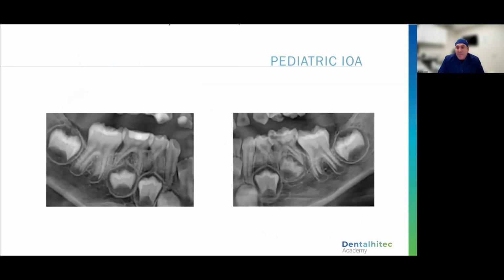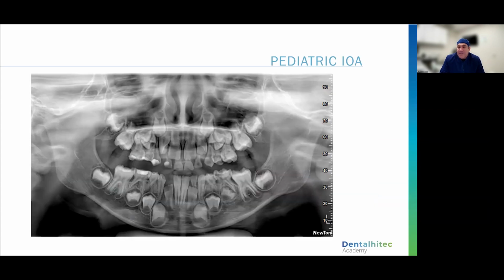There's no difference. We definitely want to review our radiographs and see where we have an adequate level of bone. Now, there's no infection here. Anatomy is quote unquote normal. You don't have issues with root proximity. And if I'm going to numb that lower right-hand quadrant and I want to numb the permanent first molar and S and T there, I'm going to give distally to tooth number T. You could also give mesially to tooth T if you're just planning on numbing R, S, and T.